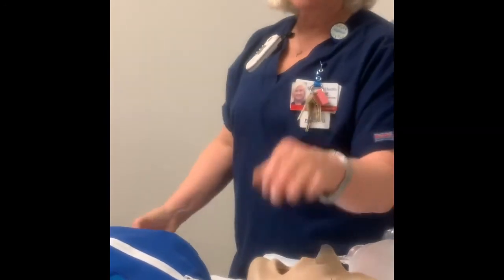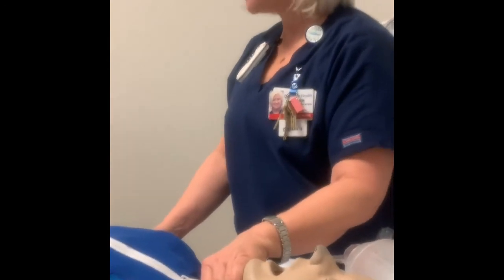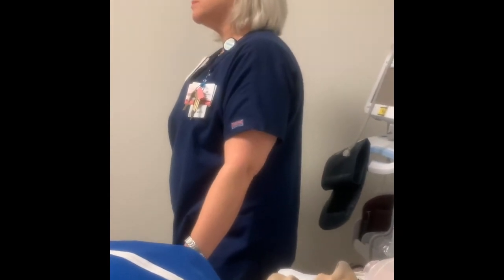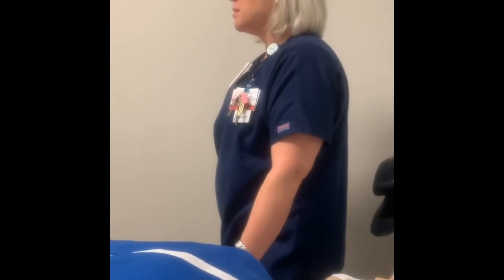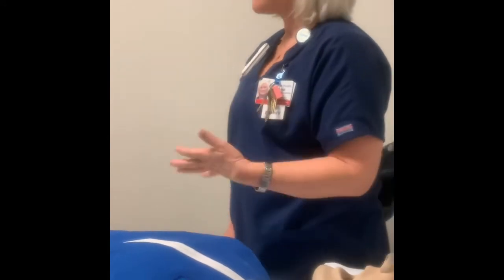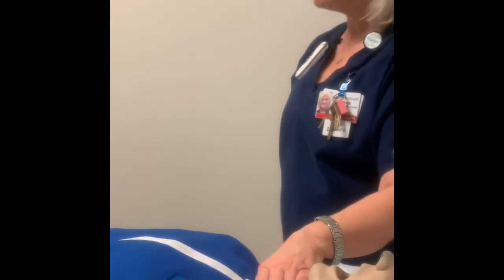Yeah, so in that event, although you can do both, it wouldn't be optimal to go up here. You just want to go down to his stoma. It appears that he's more of a mouth breather, that he's mouth breathing even though he is trached, and I understand why they trached him. He appears to be mouth breathing when you watch him. Yeah, probably. It's just a natural reflex, I think, that people want to do that. But for him, you'd want to ventilate down here, which is perfectly okay. Because remember, with a trach, you can do here or here. With a partial laryngectomy, you can do here or here. But with a laryngectomy, it's got to be here.